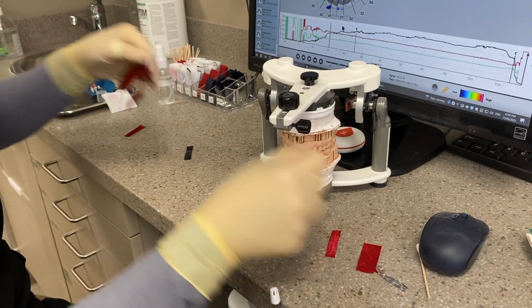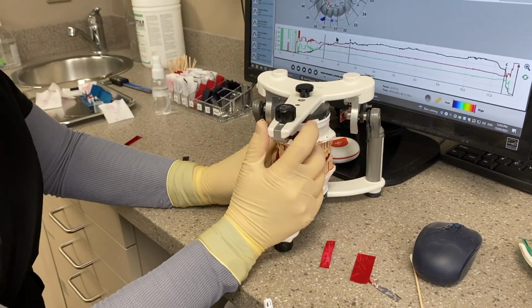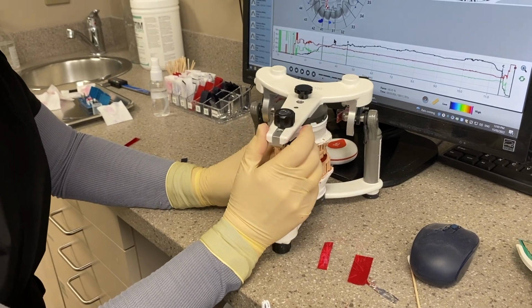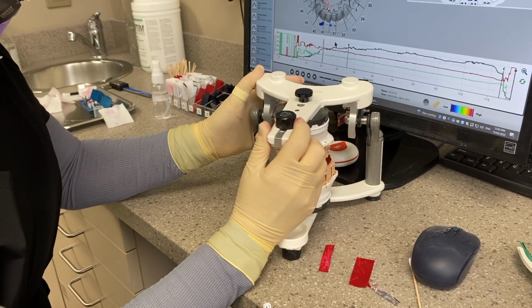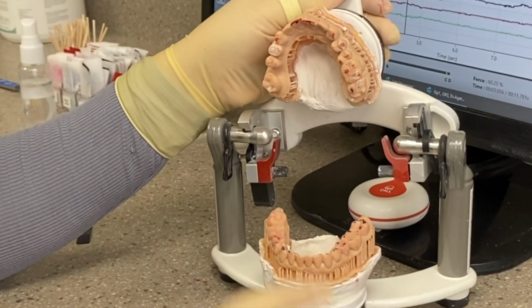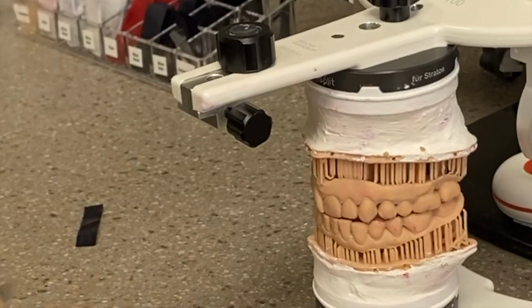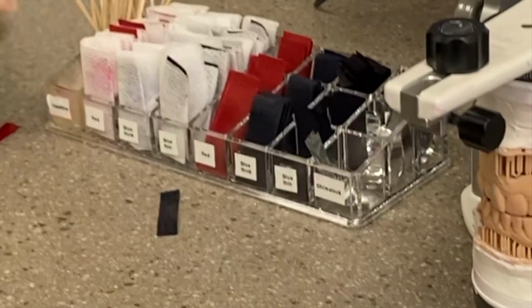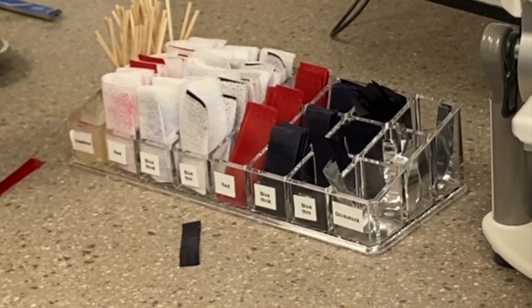So I'm now going to go back to my full arch paper, because at this point we're marking everything, and I want to see where she's really grinding. So again, front teeth or buccal cusps. And by the way, notice the little setup that we do so that you have access to lots of other extra paper.